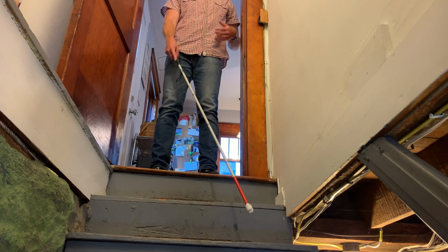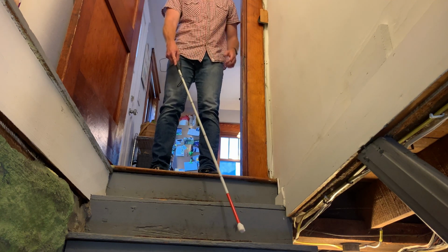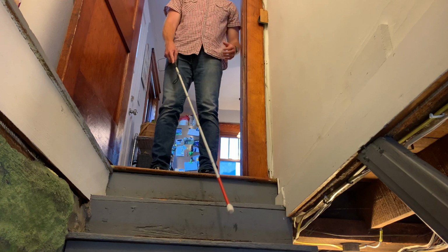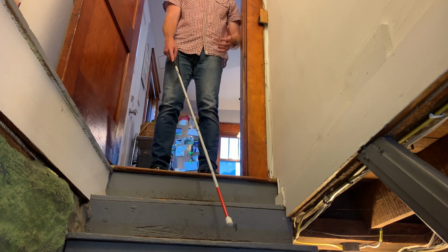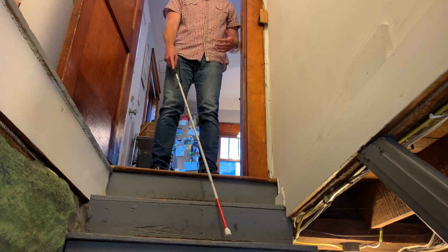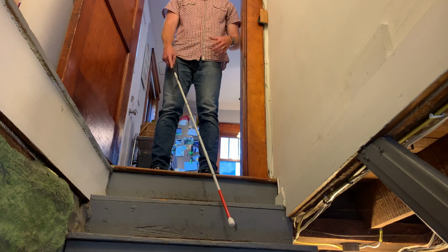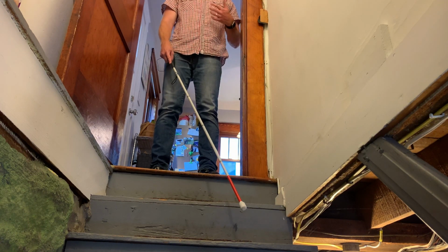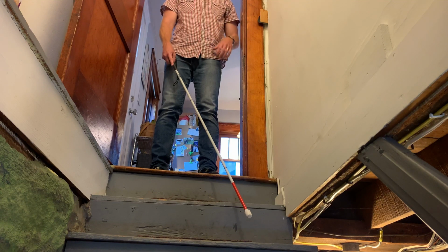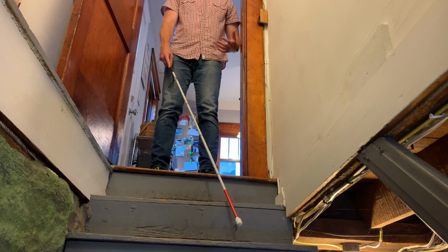And now I want to have the cane hovering either over the first step or the second step. So depending on how long your cane is, how tall you are, will kind of depend on what stair you choose. But for me, I'm going to use the first step. So right now my cane tip is hovering a few inches past the edge of the first step. So where the first step is starting to go down to the second step, my cane tip is hovering while I'm using diagonal cane technique.